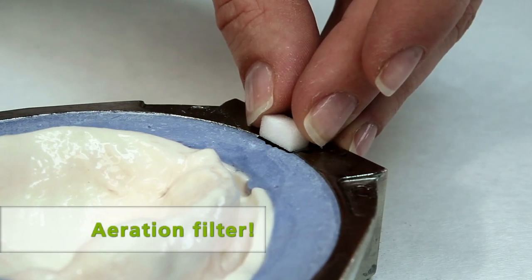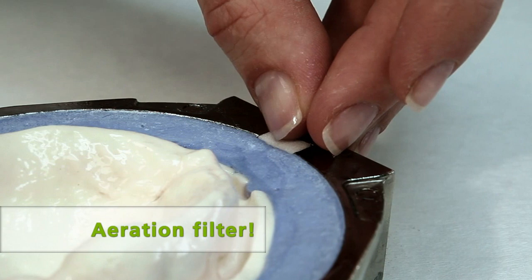Take the aeration filter and place it flush in the corresponding recess in the flask.